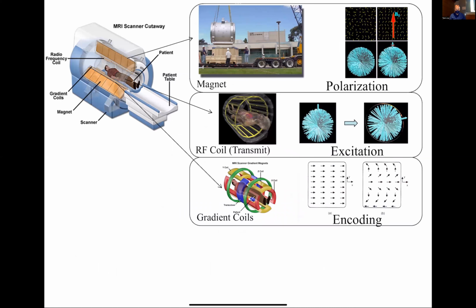Okay. So we've covered excitation, and then we've also done a little detour into relaxation because that's something that spins do. Just so you didn't get the picture that we only excite. The fact that things decay away is a very practical constraint on MRI. T2 is only on the order of 50 or 100 milliseconds for most tissue, and for bone, it can be even shorter, less than a millisecond. That places a very strong engineering constraint and challenge.